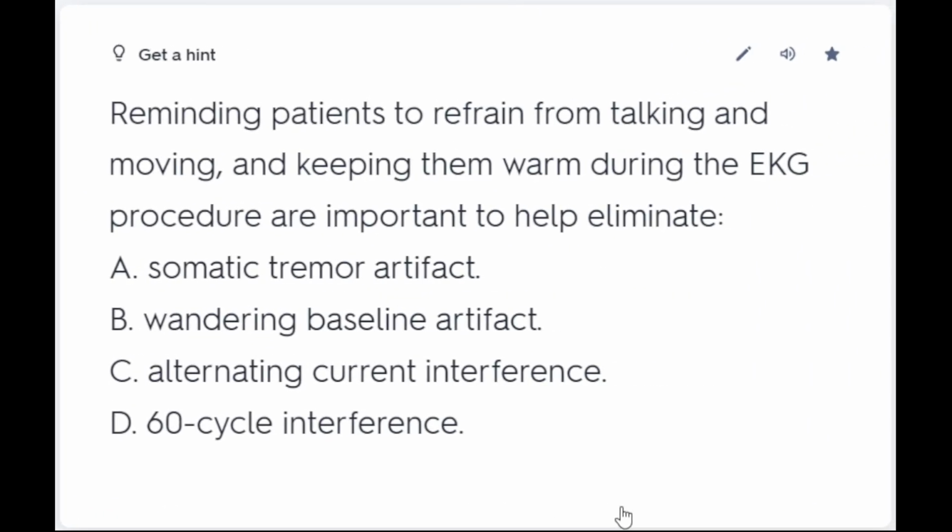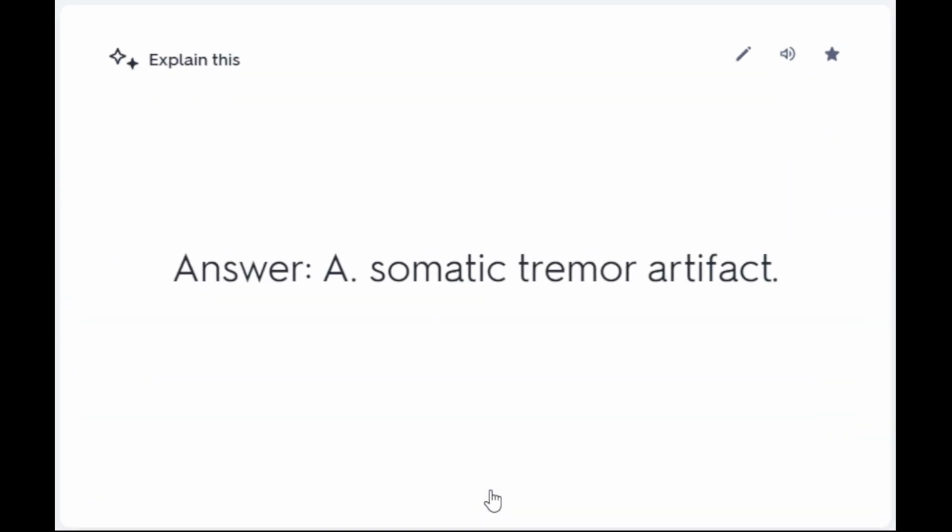Reminding patients to refrain from talking and moving and keeping them warm during the EKG procedure are important to help eliminate A. Somatic tremor artifact. B. Wandering baseline artifact. C. Alternating current interference. D. 60-cycle interference. Answer: A. Somatic tremor artifact.